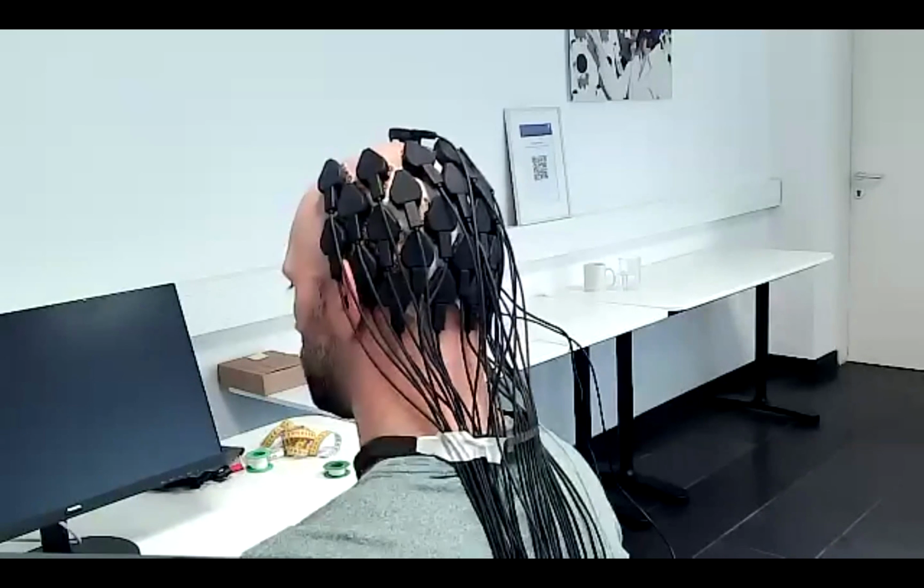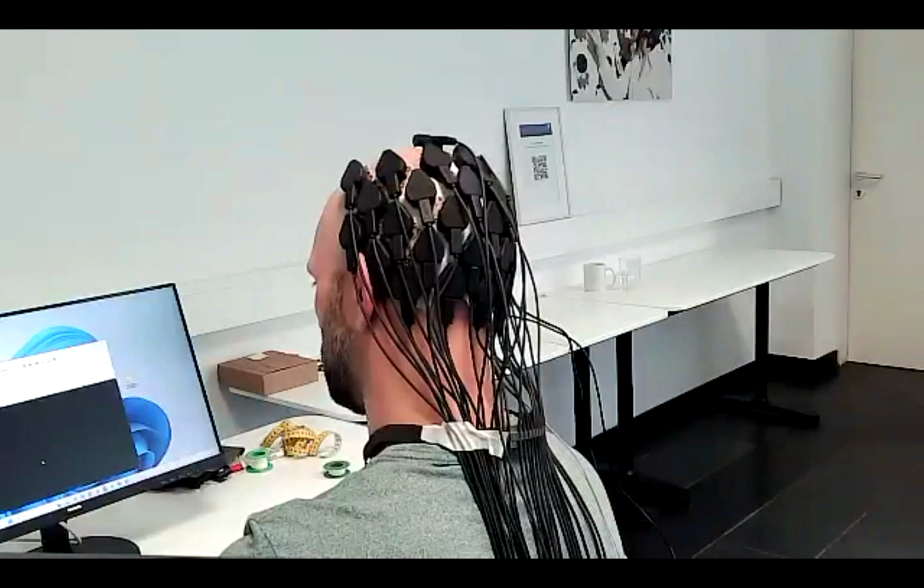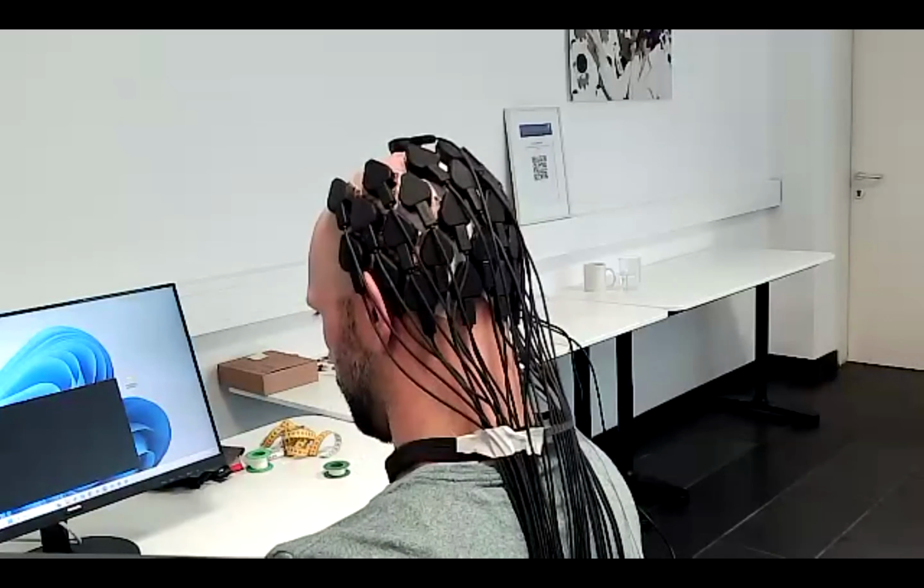And Leo, is it still possible to show all the EEG channels on the screen? Or are you switched off? I can run again, yes. Could we see channel 16 of the pangolin grid, which is over CSET? Let me try to open the... I don't know how easy it is to find this channel. Maybe it's the last channel of all recordings.